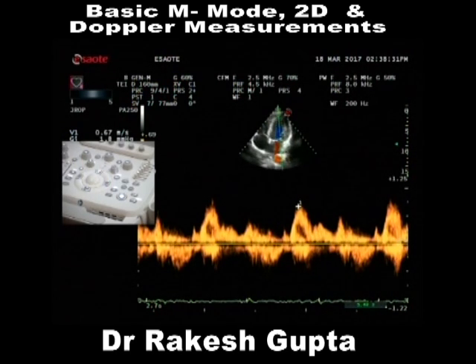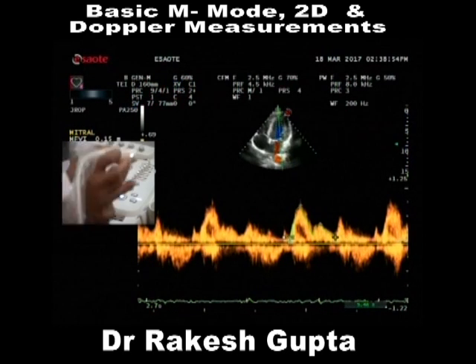Similarly, we can trace this. You go to measurements, I'll trace this mitral. I am going to trace this whole envelope. Can you get rid of the box now? Camera off kar do.